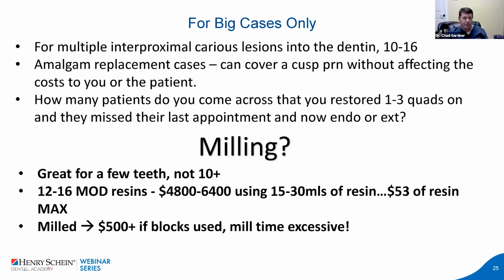You prep. You have to learn how to do the prep. That's the hardest part. Do the prep, you scan, you leave. You train your assistants to do the rest. You come back, they've tried them in, they've taken x-rays, and you come in, you prepare the intaglio, and you bond them in.